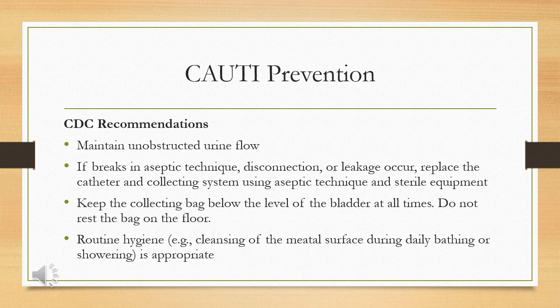Keep the collection bag below the level of the bladder at all times. So again, don't set the bag on the floor, and don't set it on the side rail. There should be a slight level of resistance downwards and below the bladder. And then of course, routine hygiene.